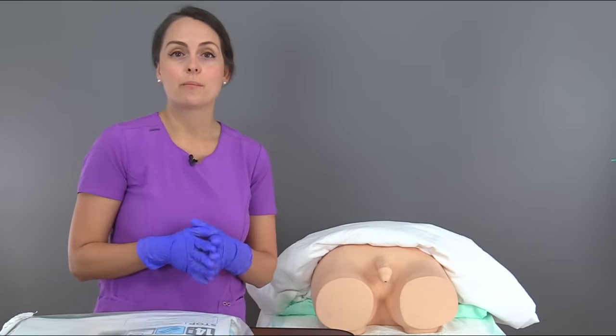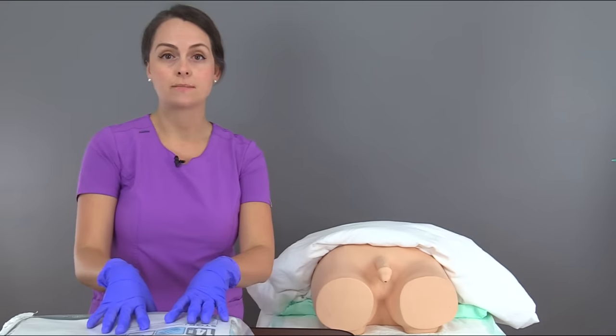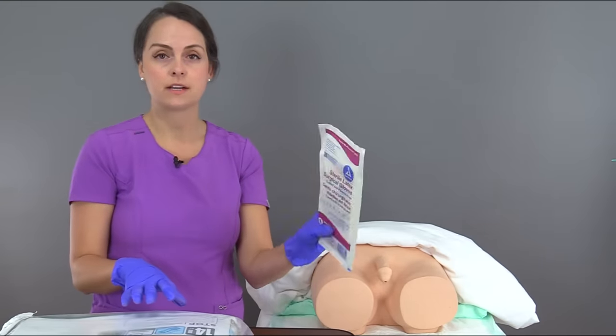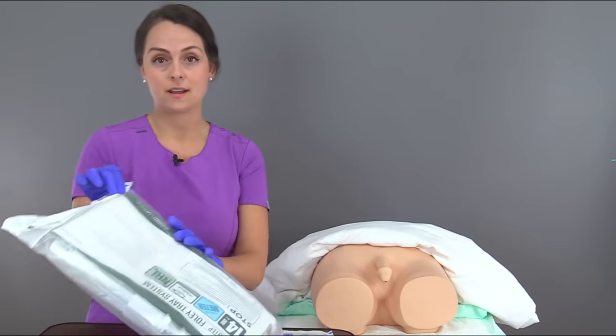Now I'm going to set up for peri care. In this Foley tray, it has soap wipes that assist with doing this. I also have an extra pair of sterile gloves because sometimes the gloves that come in the kit don't fit. So let's open up this kit and get set up.